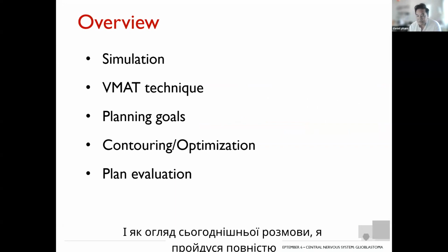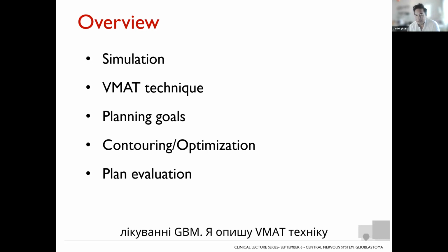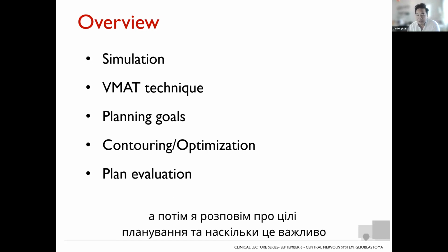And as an overview of the talk today, I'll go through briefly the simulation process, the important aspects of simulating a GBM treatment. I'll describe the VMAT technique. We primarily use a RapidArc or VMAT technique for treatment delivery.